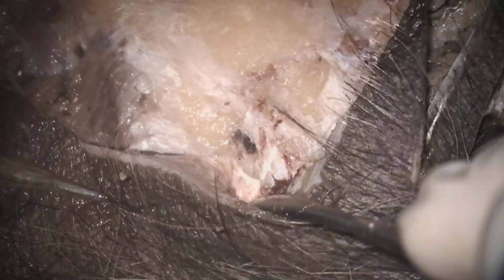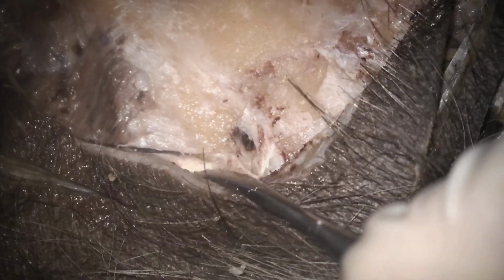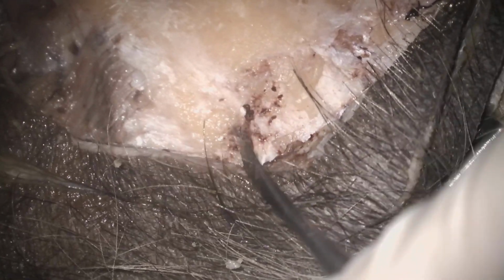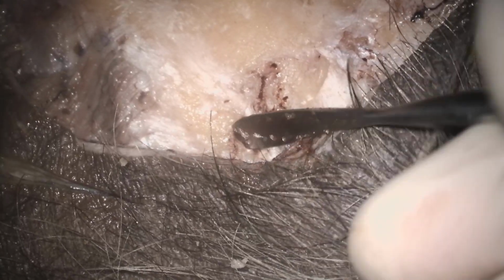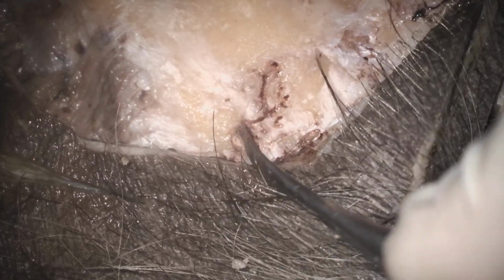Because in live surgery also, if you go far posterior from the cortical bone, you will encounter a torrential bleed from that area, and this is the emissary vein. Depending on the anatomical variation, some patients will have a larger channel, some a small channel of this emissary vein. And one thing, you cannot cauterize the bleeding from that emissary vein, because this is a wide channel and that is going deep into the bony cavity.